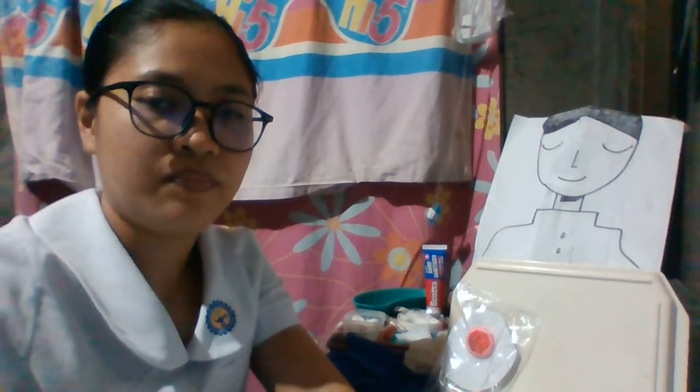And today, I am going to perform colostomy care, changing an ostomy appliance. The purposes of this procedure are to assess and care for the peristomal skin, to collect stool for assessment of the amount and type of output, and to minimize odors for the client's comfort and self-esteem.